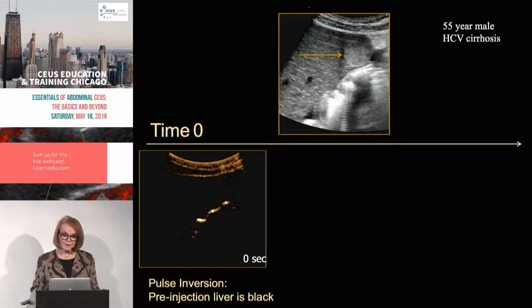So again, you can see that the liver's gone away and that the echogenic mass has gone away.